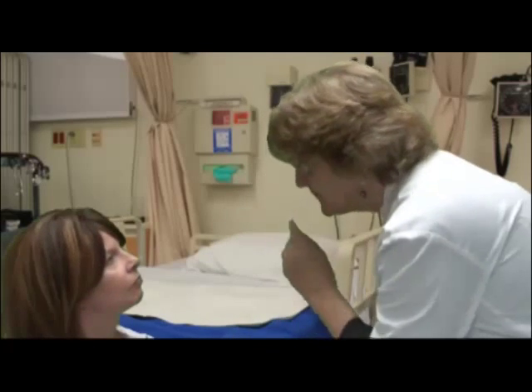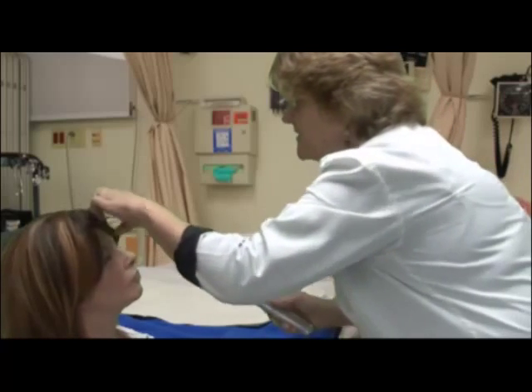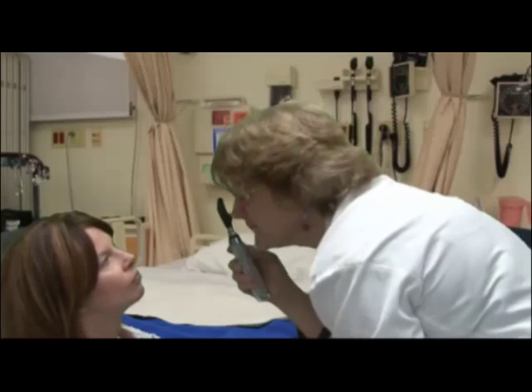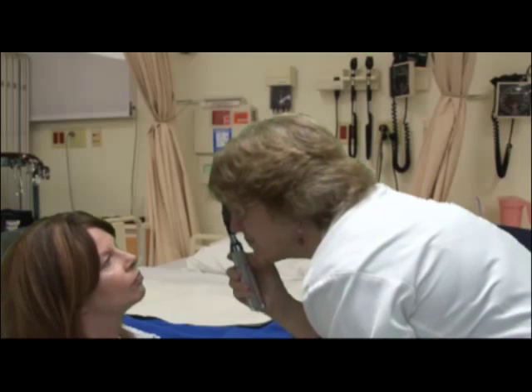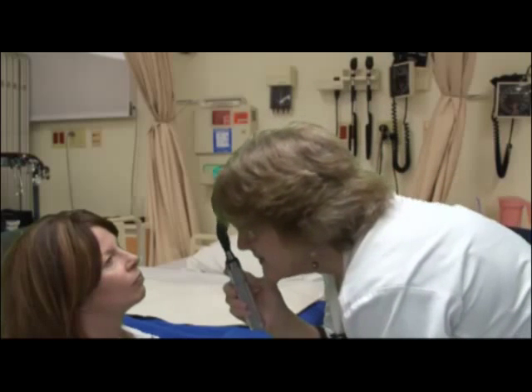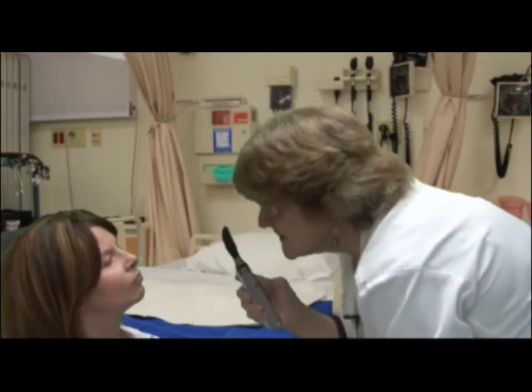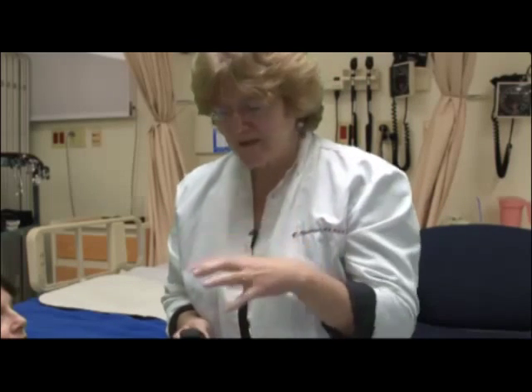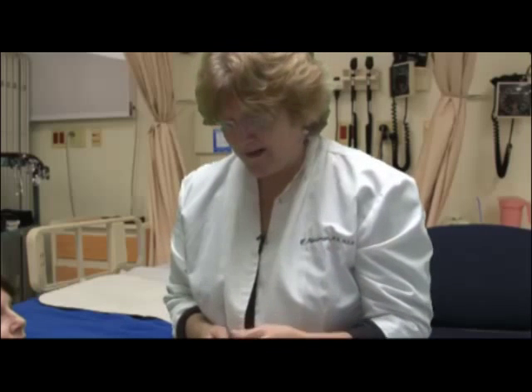Okay, excellent. All right, so what I'm going to be doing is looking through this light and just looking at a red reflex. So have your patient look directly at my nose, and what I want to do is just look in your eyes through the ophthalmoscope. And when I press it on her pupil, I see a red reflex. Thank you very much. Now I'm going to look in the other one for a red reflex. Excellent. The red reflex means the reflection of the light on the back of her retina, and it's clear it is a red reflex. If it were white, she might have a cataract.